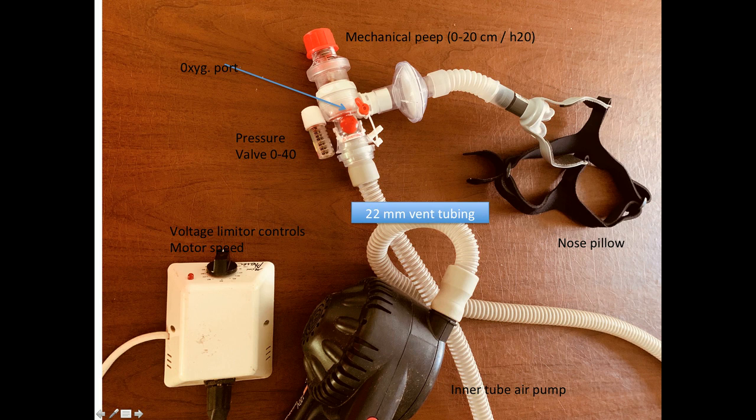The setup is shown in this slide. An Ambu bag has been removed from its valve apparatus up front, and an air hose output from the motor is plugged into where the Ambu bag used to be. Here is the setup. Remarkably, everything fits. Note, if needed, there is also an oxygen port.